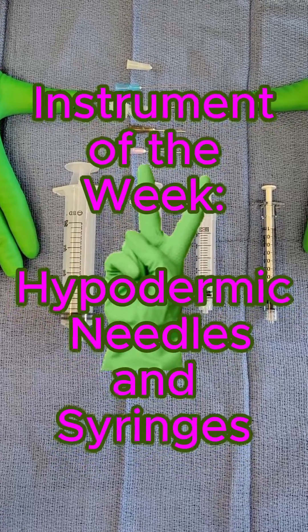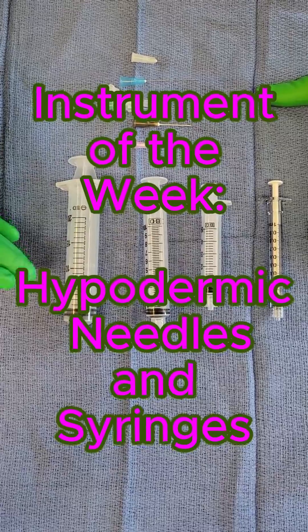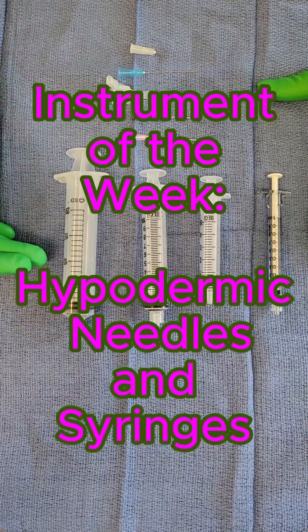Hi everybody, welcome back to another segment of Surgical Instrument of the Week. This week we wanted to talk about hypos and syringes.